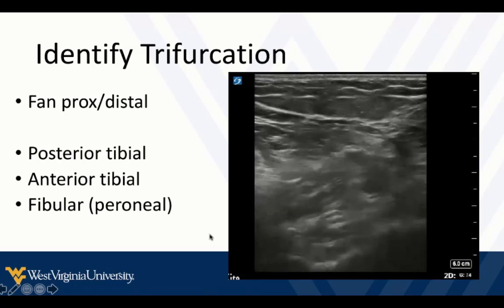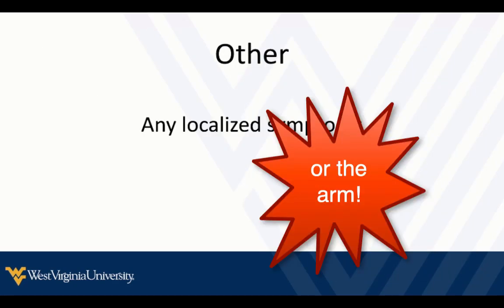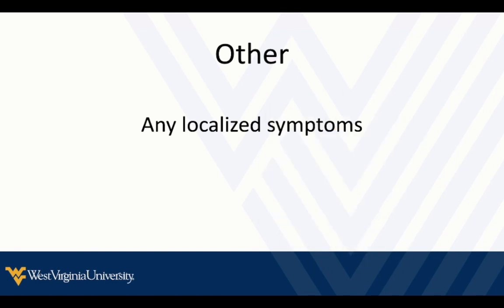If you see bone as you compress, that's a good clue you're imaging deeply enough. Any other place on their calf where they say it's really red, swollen, tender, and it hurts — take a look at that area. See if there's cellulitis or some kind of superficial thrombosis. If you see any thrombosis, follow it proximally and see the extent of it, and see if it's next to an artery. If you see a thrombosis next to an artery, that may be a deep venous thrombosis.